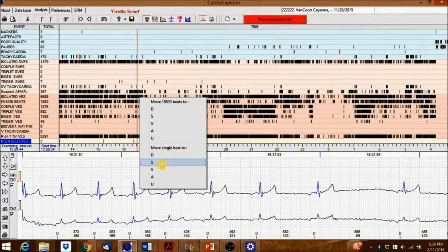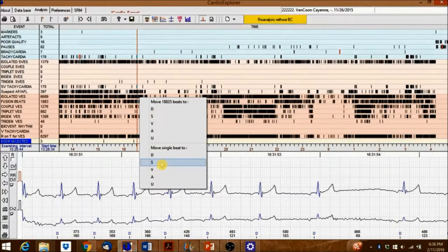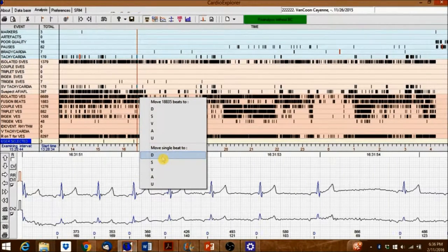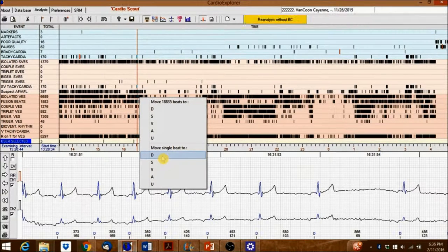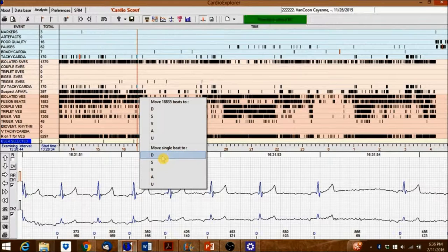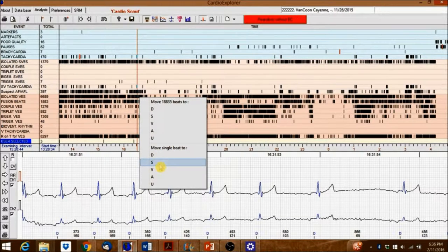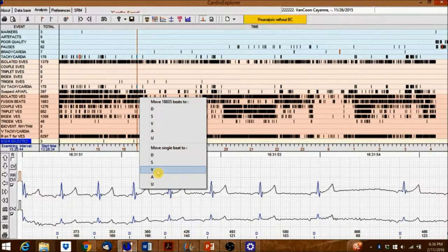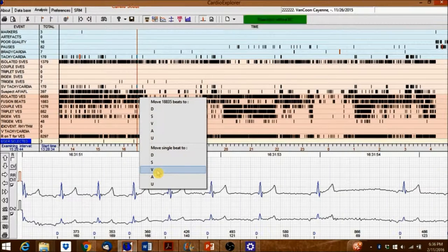Beat categories include D for dominant, marked blue, V for ventricular, marked dark red, S for supraventricular, marked light red, A for artifact, marked pink, and U for unknown, marked orange.